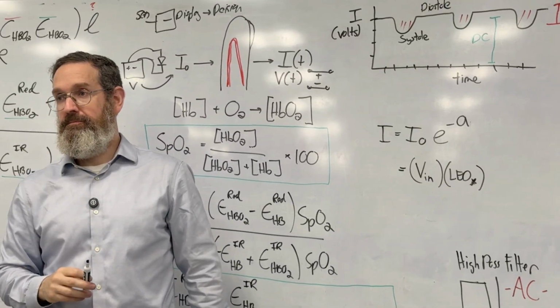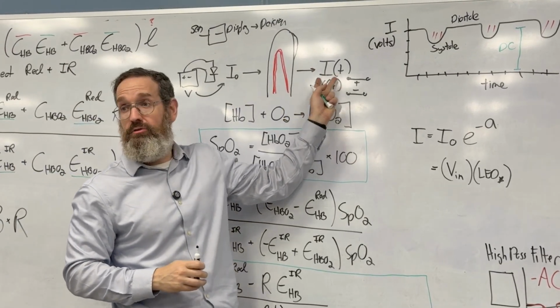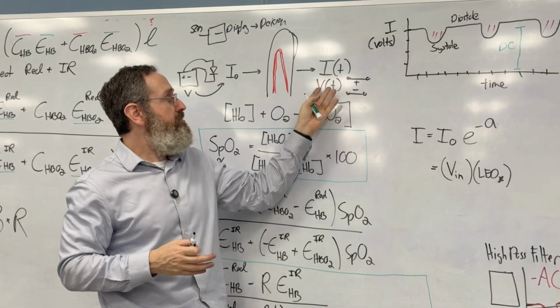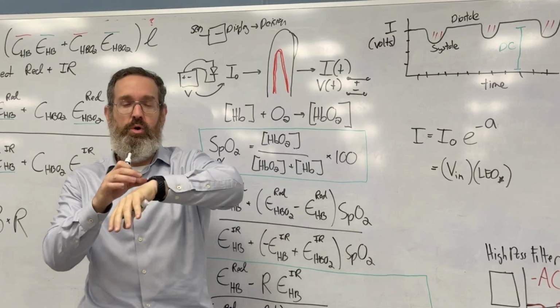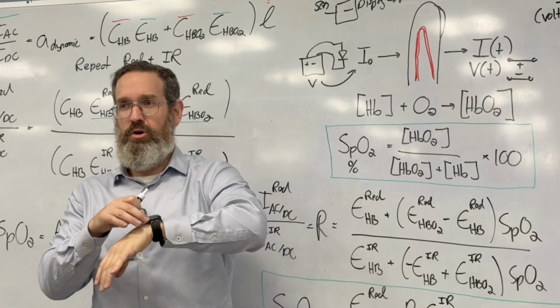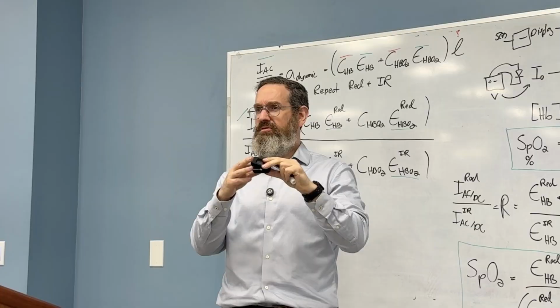Nope. Now, when the light comes out, we convert the light to a voltage, right? If you tell me how much light came out, well, I don't know. Why do you not know? Because I'm not really sure how my photodiode works, and it turns out that in reality there are a lot of different issues.